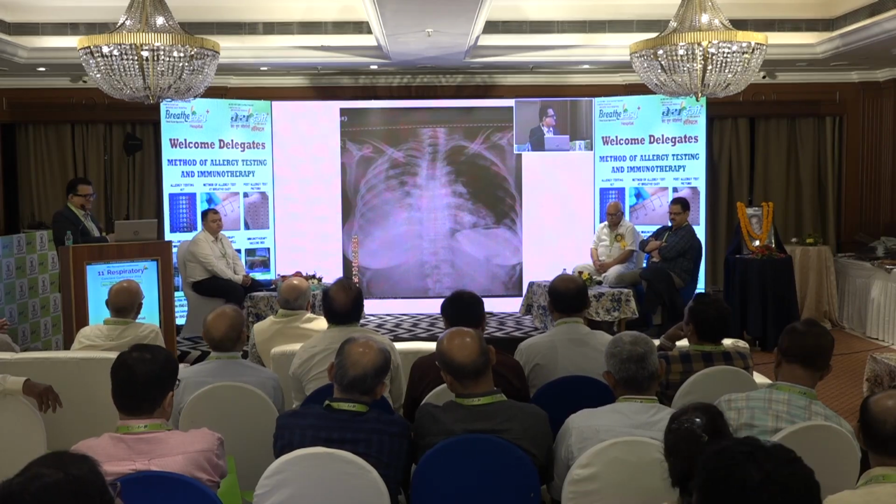Then she comes to us. Look at this, at 4 o'clock. I got a time here in the evening. Again, a repeat pleural effusion after 4 tappings. We put in an intercostal drainage tube, relieve her breathlessness, and now we want a diagnosis for this patient here.